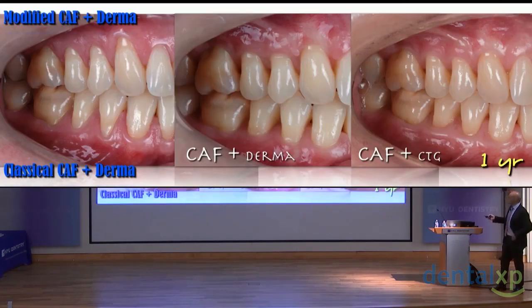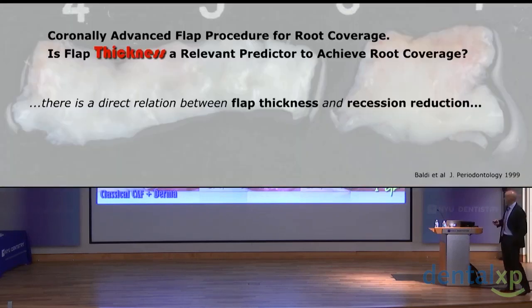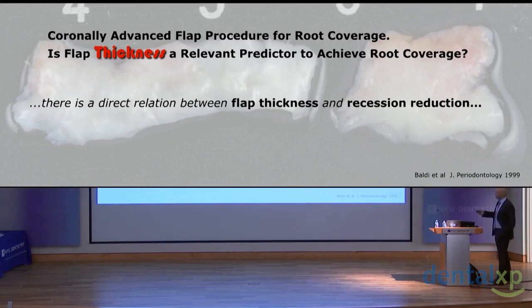So let's compare before, after cuff plus allograft, and after cuff plus connective tissue graft, 1 year later. Definitely, for me, connective tissue graft works better. And this is what the literature tells us: there is a direct relation between flap thickness and recession reduction and the stability of the results.